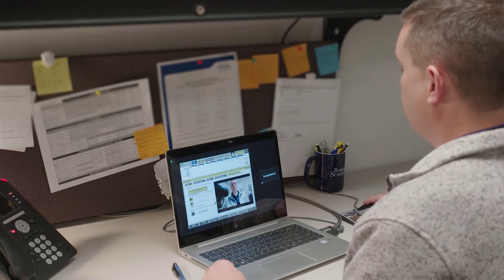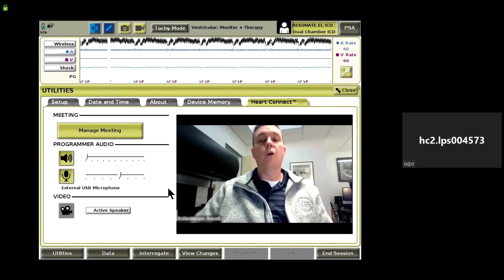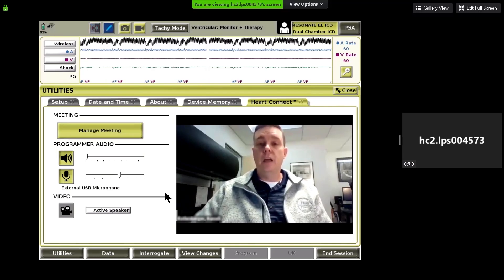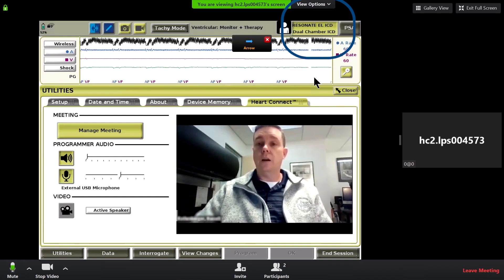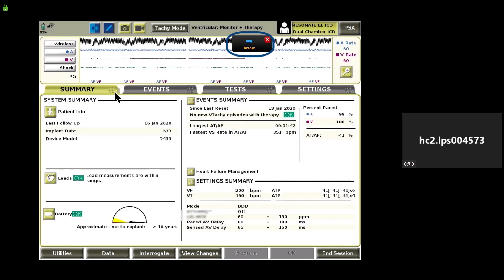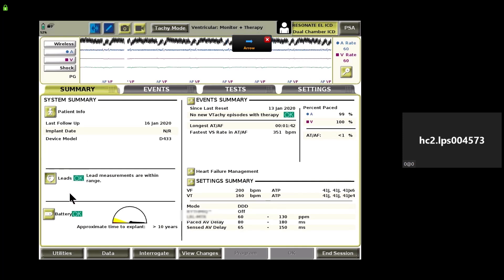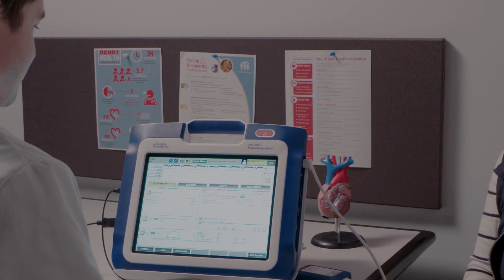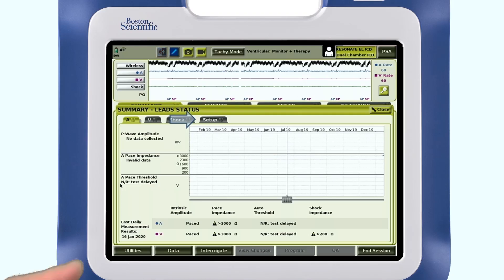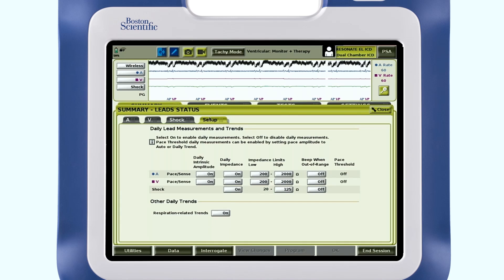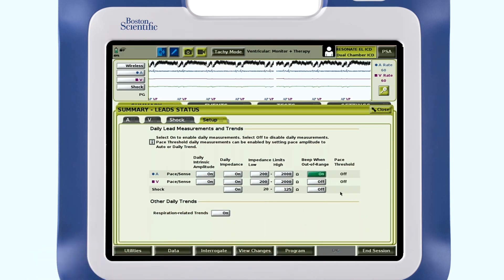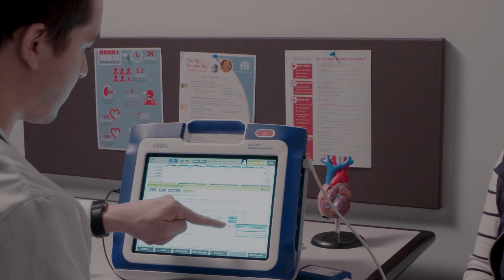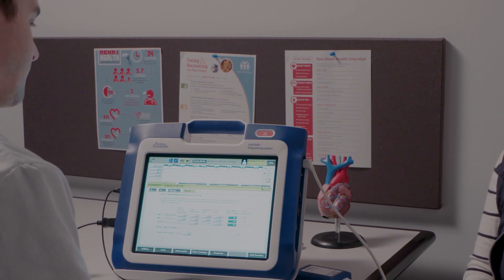Annotation can be made by the users. Remote users will need to tap the More or View Options menu at the top of their screen and then tap Annotate to bring up the annotation menu. A local user can use the annotation feature by tapping the blue pencil at the top of the programmer screen and then touching the screen where they want to provide the annotation. Touch the pencil again in order to annotate on another location. From there, hit the Setup tab. There you will see 'Beep when out of range.' Please turn those from off to on, then hit Program and you're all set.